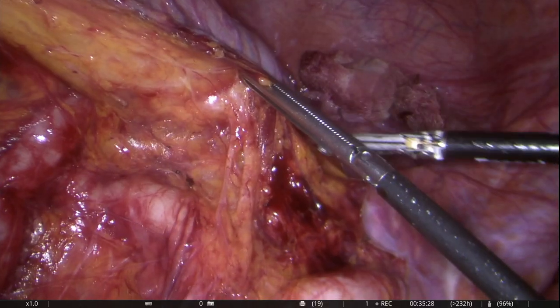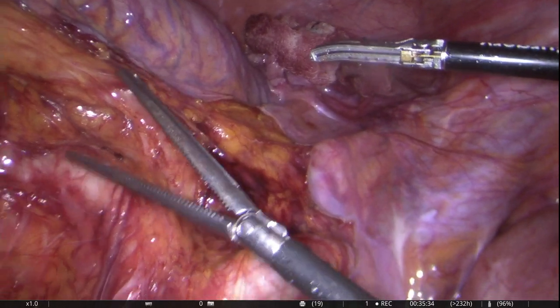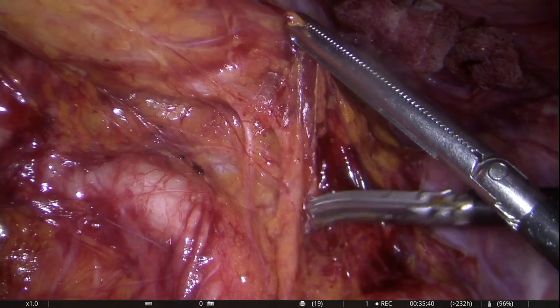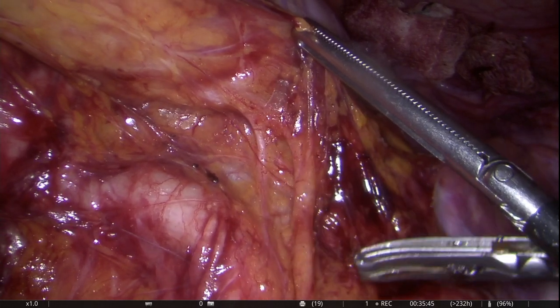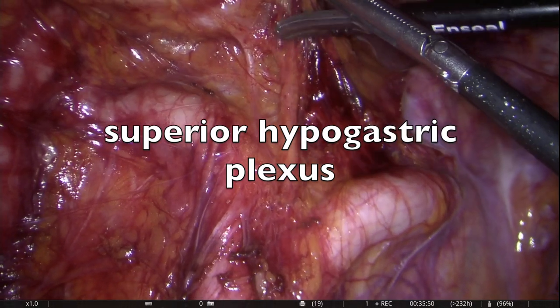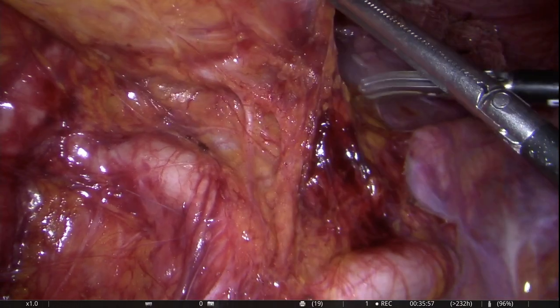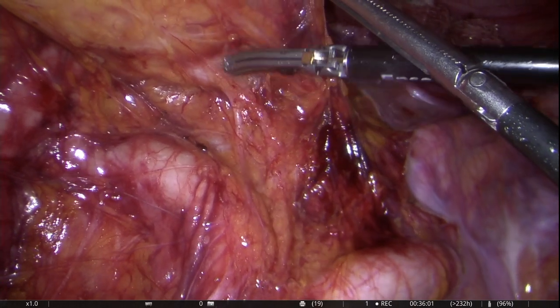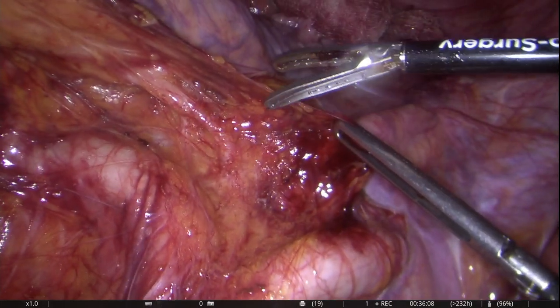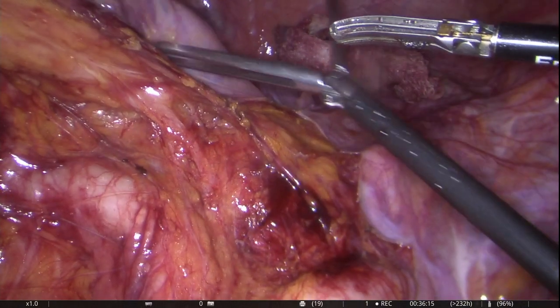Attention is now being diverted to open up the top of the TME plane while demonstrating and preserving the superior hypogastric plexus and the right hypogastric nerve. It is very important to identify the plane between the nerve plexus and the TME fascia layer.